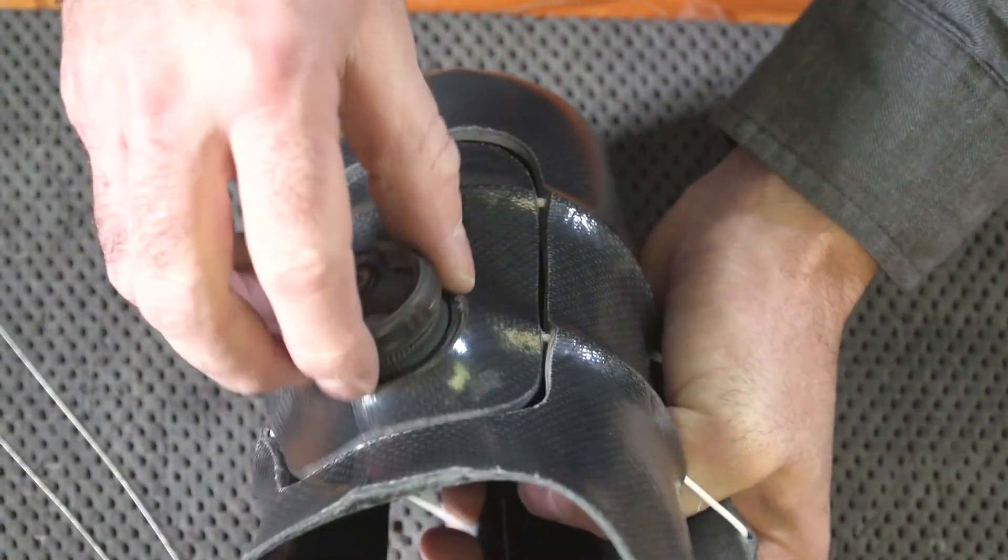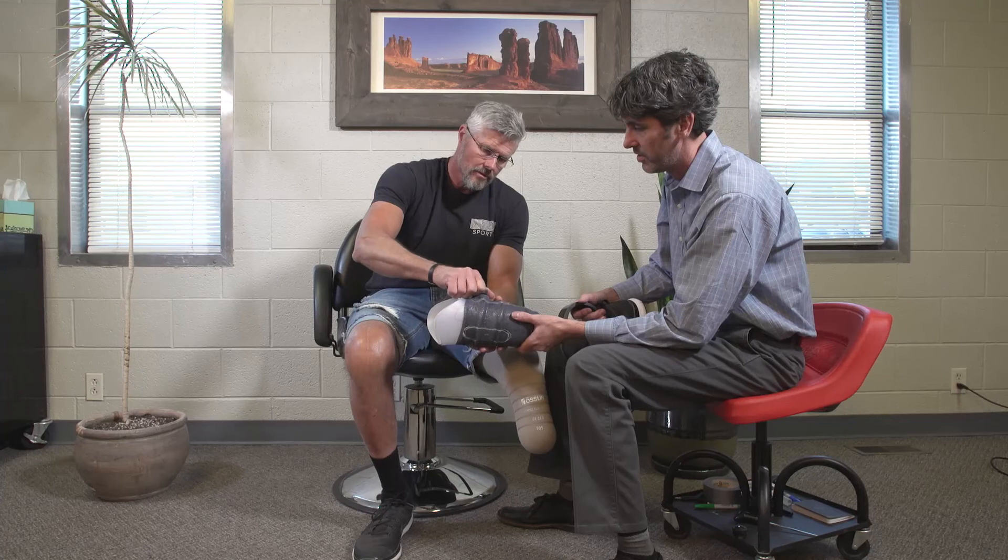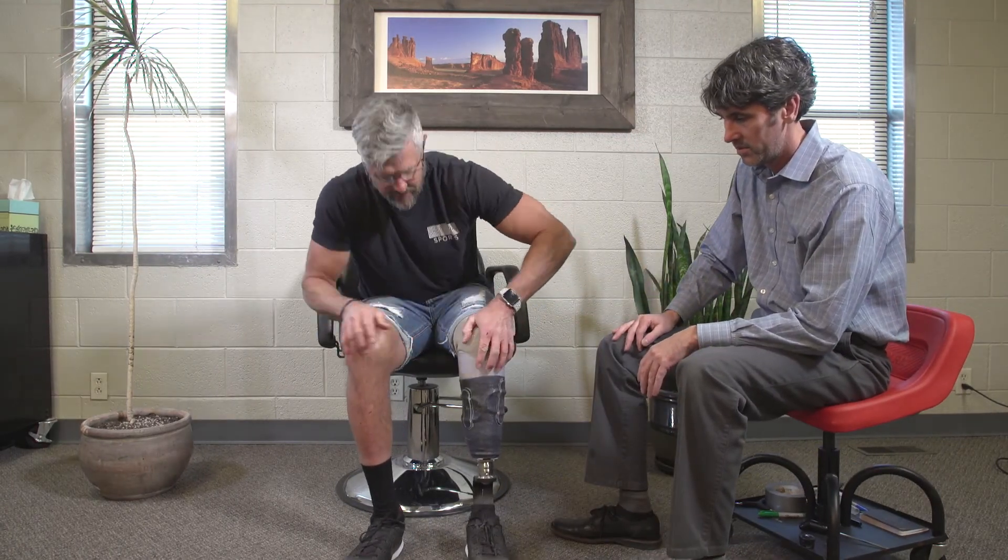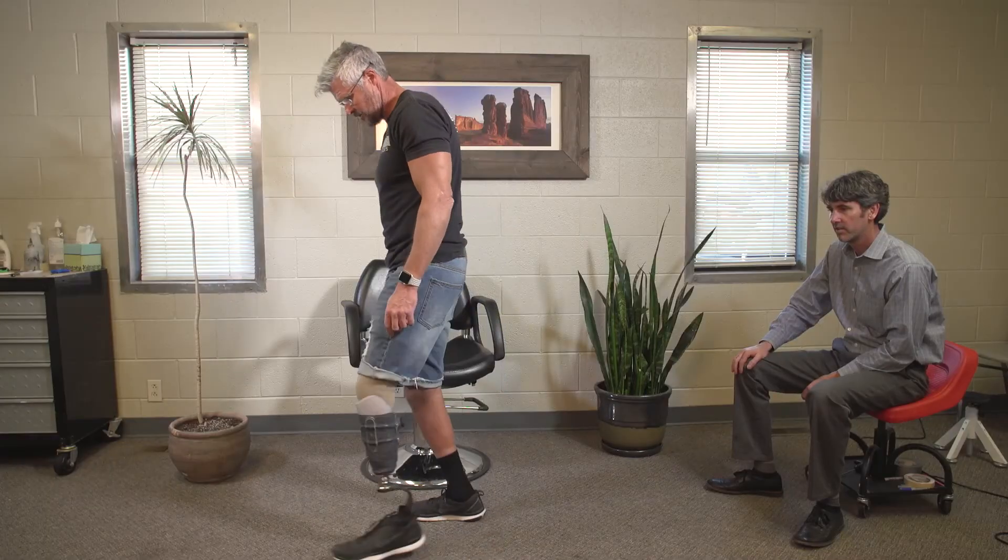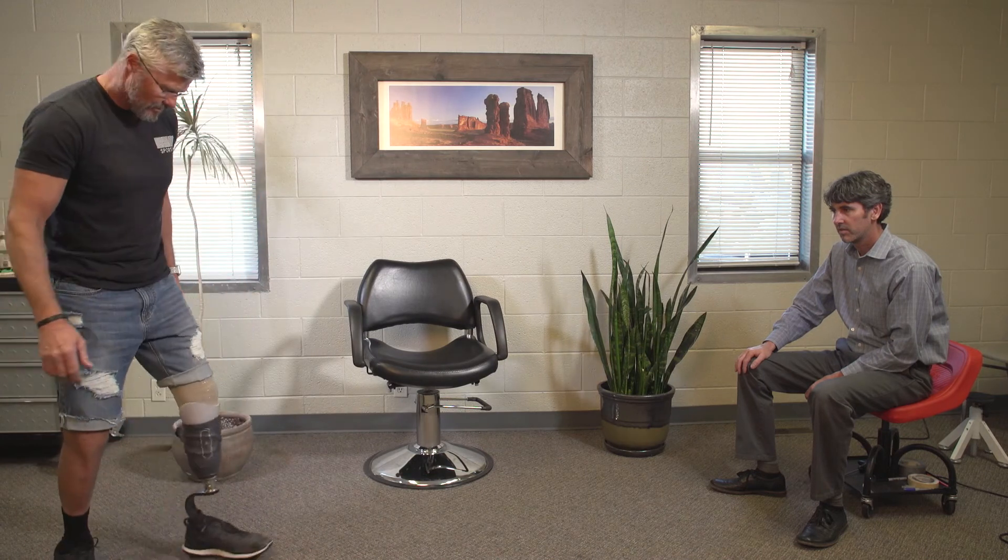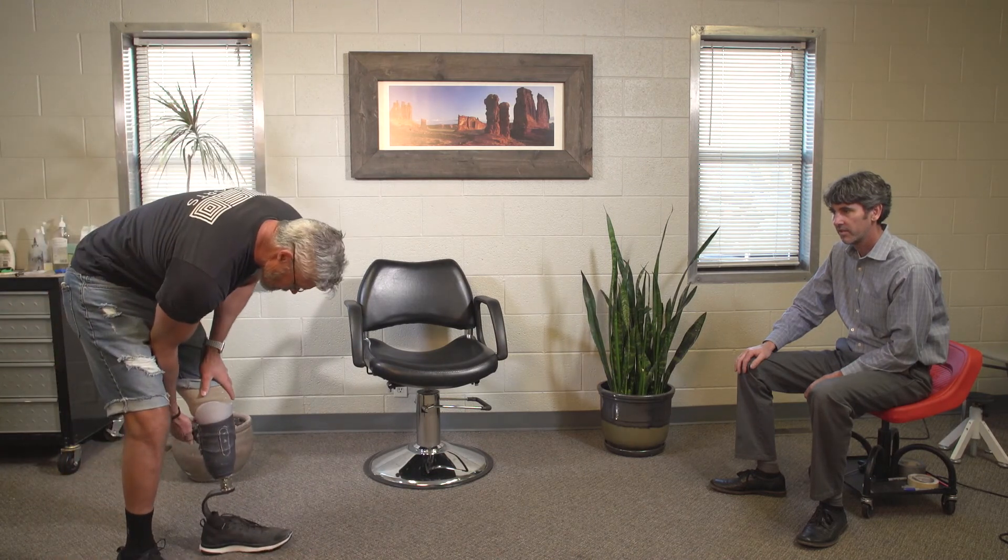By designing and testing adjustability on the check socket, you can be sure the definitive will be awesome. So when the whole family, including grandma, comes to your office to see your patient take his first steps, you can be totally confident it'll fit.